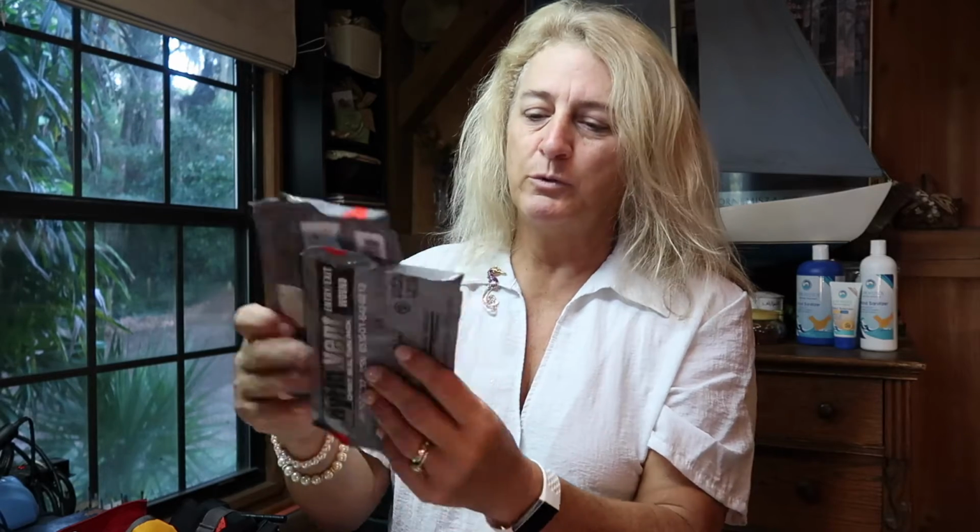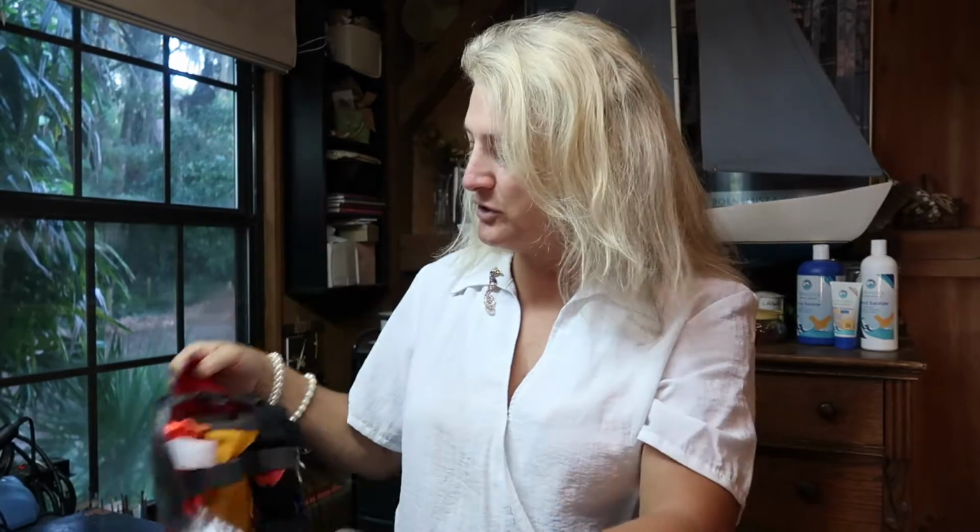Maybe we pick up somebody who has had an accident with one of the harpoons when they're spear fishing, something like that, and they actually have a puncture in them, then they have a sucking chest wound, then we would go for these. There are 4 there, plus you can use the packets. And that is it. That is all that is in my bleeding control kit, just things to stop the bleed.